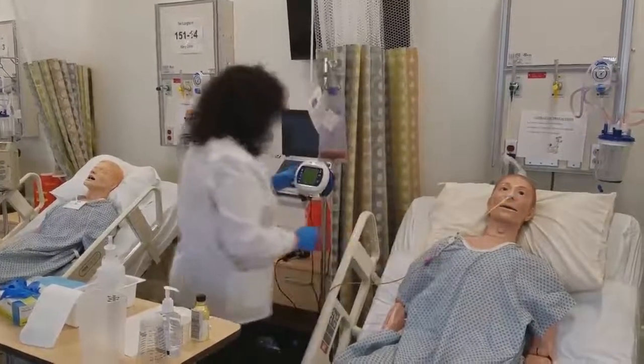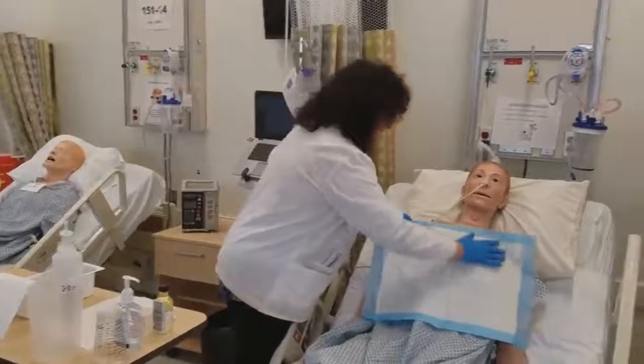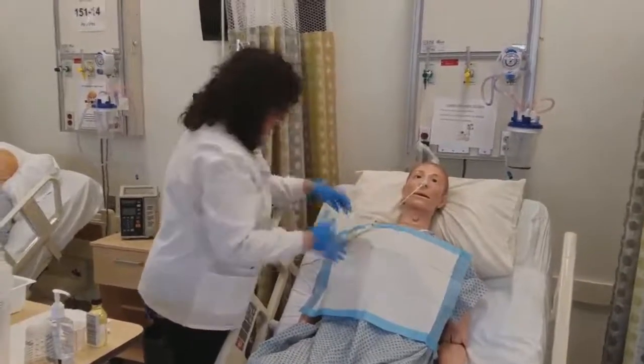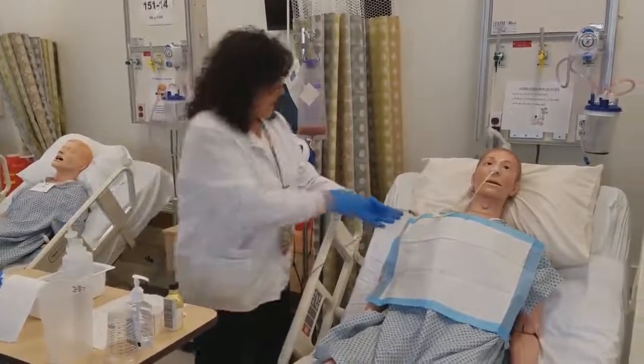And then I'm going to go ahead and put my tube feeding on hold. And I'm going to get ready to pull back some aspirate. My aspirate will kind of look like curdled tube feeding. I might see a little presence of gastric contents in there, but predominantly what I'm going to see is tube feeding.